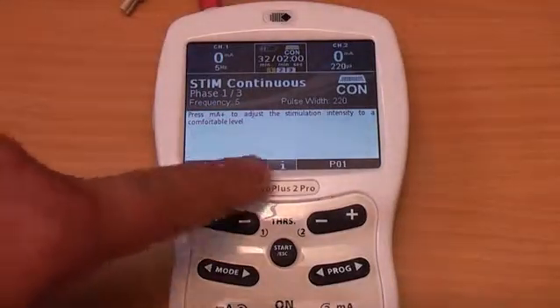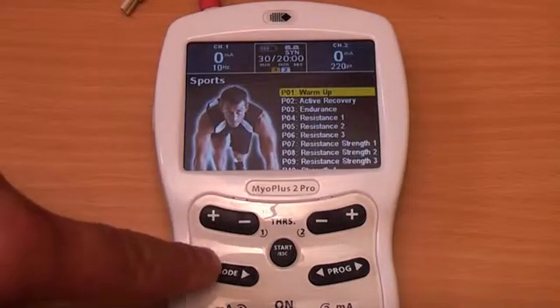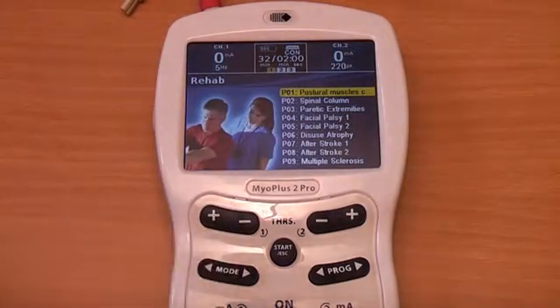In this particular case, the unit was used for rehabilitation mode program 1. To see the list of all available programs, press the mode or prog button.